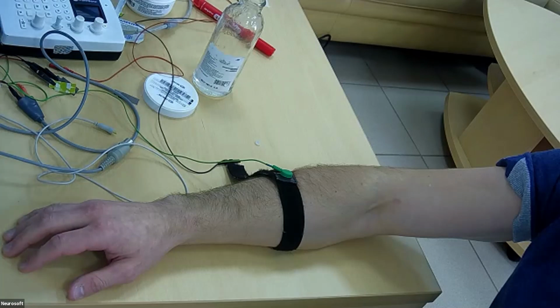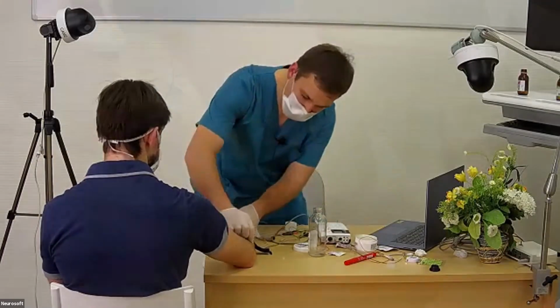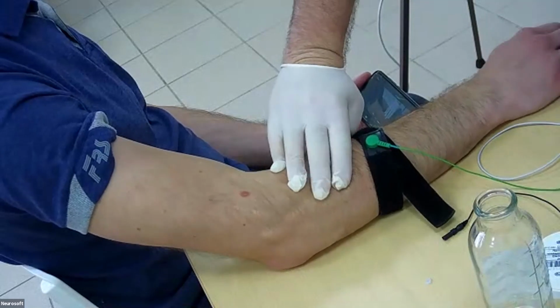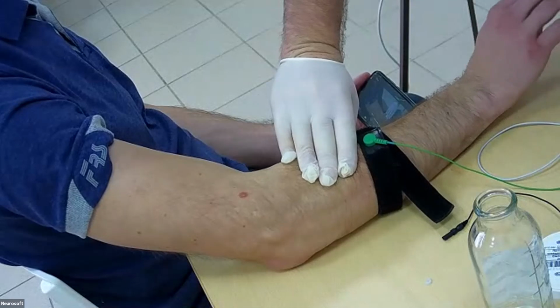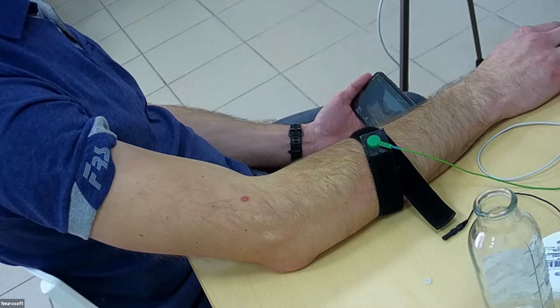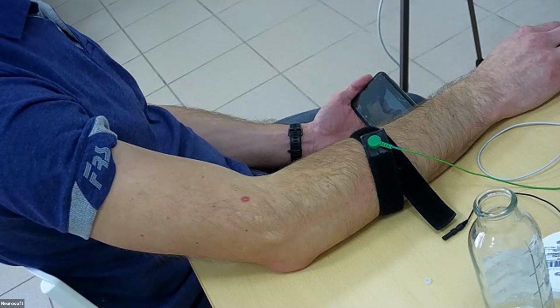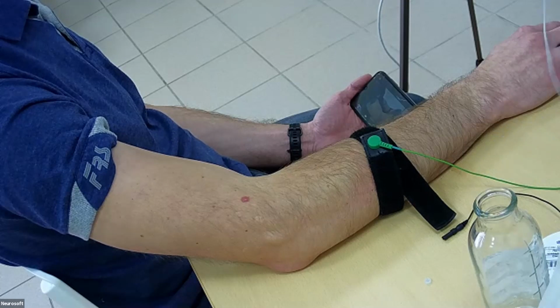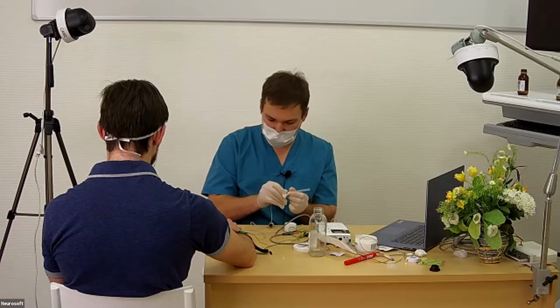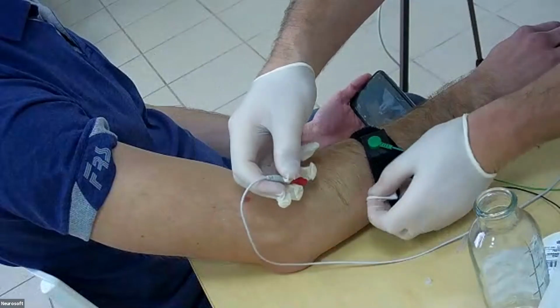We scrub the skin. Ask the patient to move. Okay, find the muscle. Okay, relax the muscle, please. We can insert the needle.